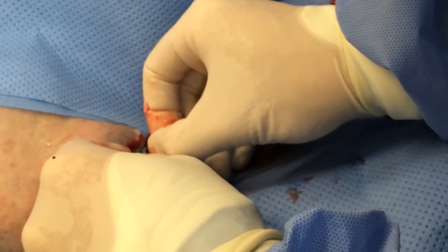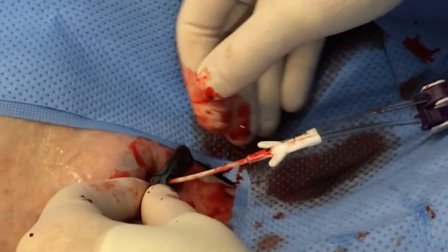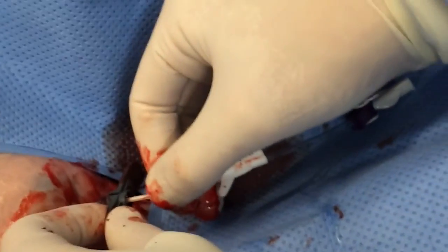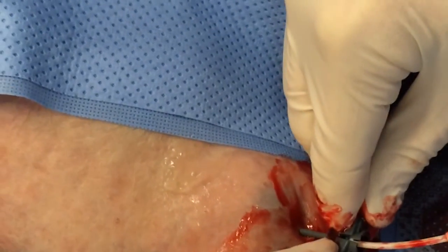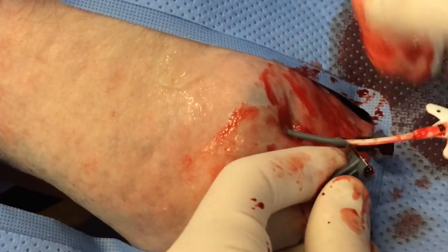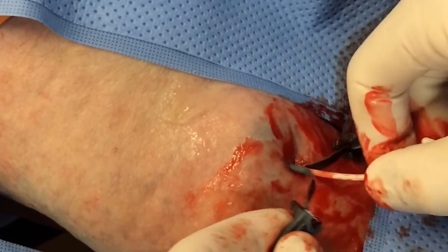All right, that looks like a good amount, but Rory wants one push more. Okay, there we go. That's the right amount to have out, about 3-4 inches. You'll pull back on the dilator and then just crack it, and it'll split in half. And then you're going to pull it down till you're near the skin, but not at the skin. You don't want this breaking apart inside the skin.